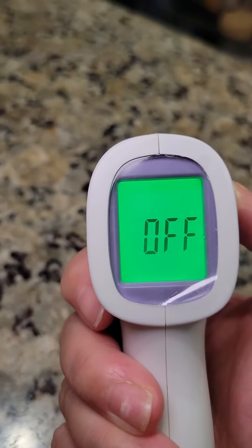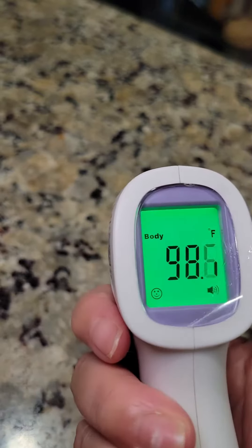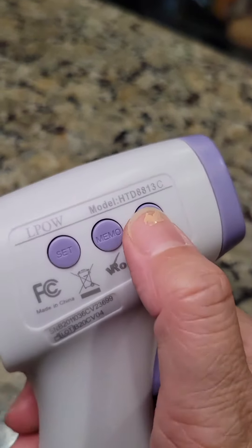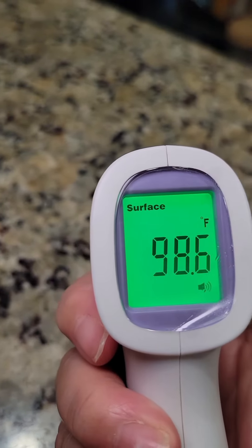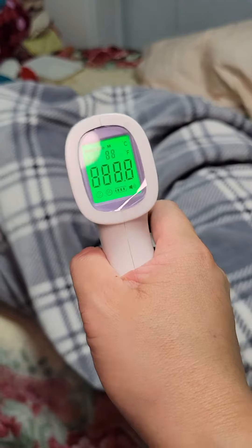To turn it on, press the trigger button. There are three buttons on the side: the set button to turn on and off, the memo button where you can store up to 50 memory recalls of temperatures, and lastly the mode button to switch between body temperature mode and surface temperature mode.